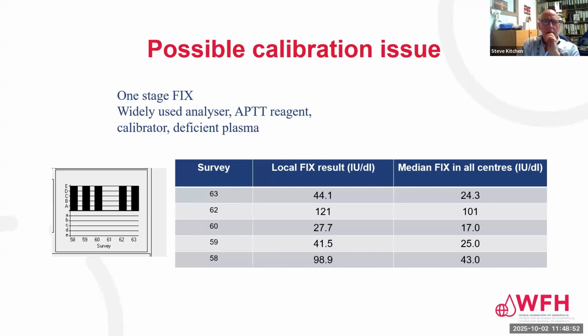And before we come to this slide in calibration, I can tell you that this problem with testing 3 dilutions has been really quite common to see as the cause of errors in our IEQAS participant group. Some labs have been unable to test 3 dilutions, and had highly variable results, but on introducing use of 3 dilutions, have seen a good improvement in their local results.